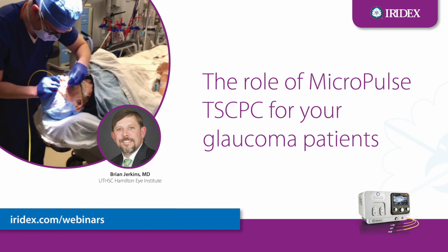Two-part question. Number one, do you treat uveitic glaucoma patients with MicroPulse? And two, do you have any experience with congenital glaucoma and MicroPulse? I've treated 1 or 2 mild uveitic patients with MicroPulse, and these were patients who had already had previous tube shunts. That is still a subset of glaucoma that I'm really cautious of with anything inflammatory. But if they've had a previous tube shunt and they're actually fairly well controlled, I have used it in those instances. With congenital glaucoma, I have not had any significant experience in that setting at all with MicroPulse yet. Okay.